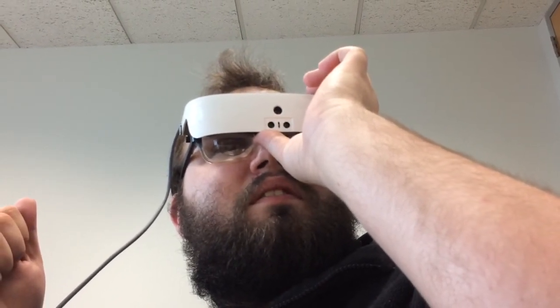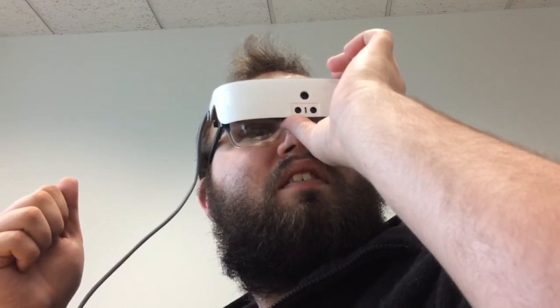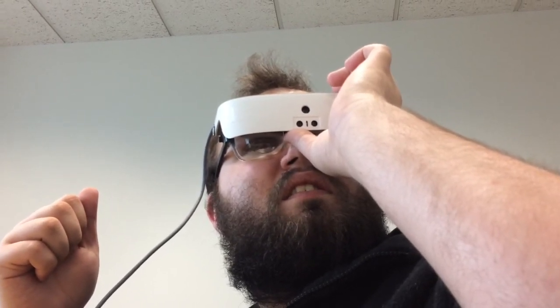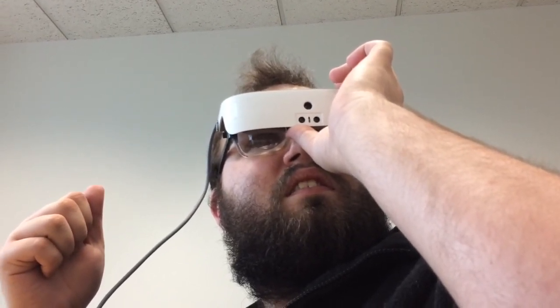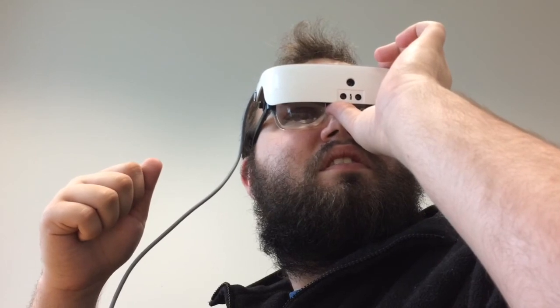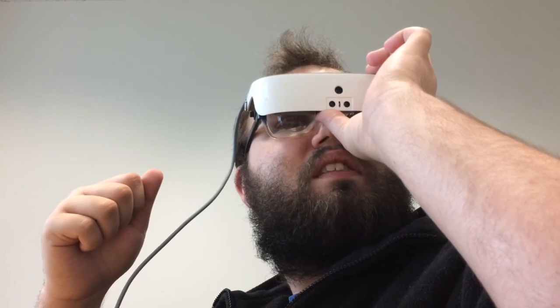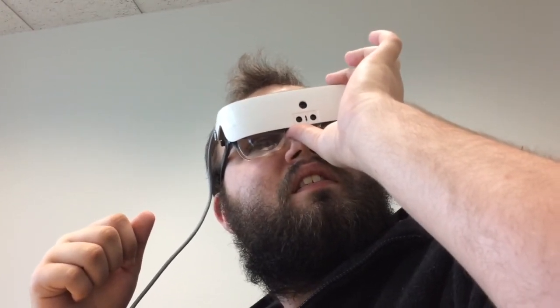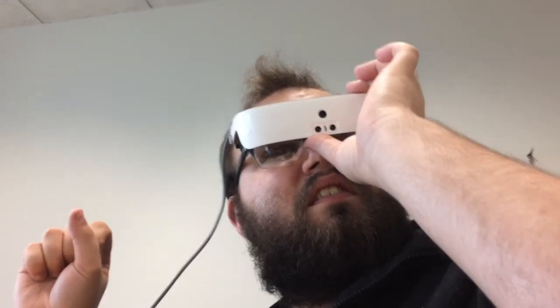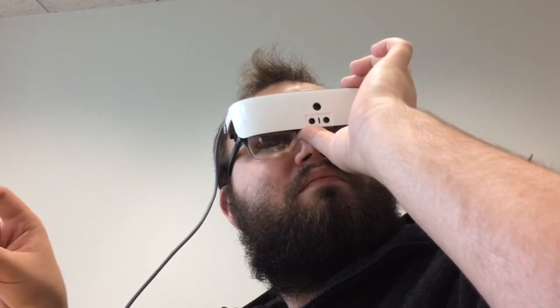The demonstrator adjusts the contrast, and the user reacts immediately — 'Whoa!' — saying it's definitely a lot better. The demonstrator then works on brightness, lowering and raising it while getting feedback from the user. After some back and forth — too bright, then too dark — they find the right brightness level. The user confirms 'Yeah, that's good. Perfect.'